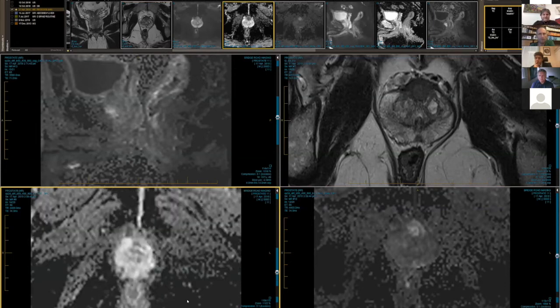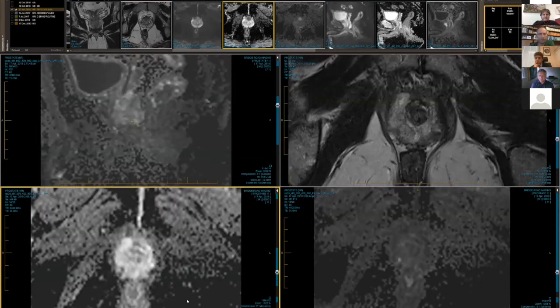Yeah, I totally agree with that logic, Roberto. Obviously that's because the smaller ones are so much easier to miss. Just a little bit of needle deviation here and there can make it hard. And there's good data supporting at least 3 cores, as you say, per target lesion. But there's not much point in doing more than that for the big ones, because you're going to hit it. If it's large, you can easily get smack bang in the middle. But those little ones can be tricky.